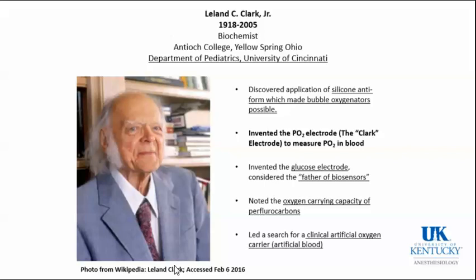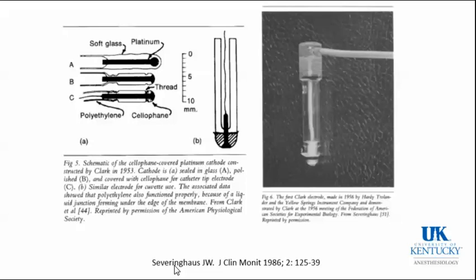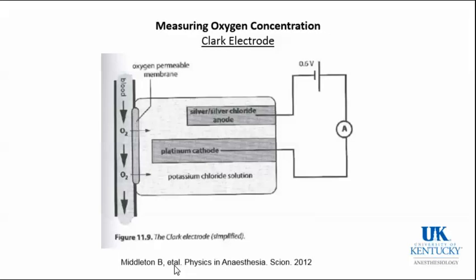He observed the oxygen carrying capacity of fluorocarbons, which led to the search for clinical artificial oxygen carriers. Quite a guy. And this is a picture of his original electrode in a review article by Dr. Severinghaus.